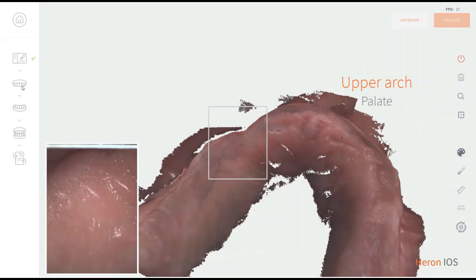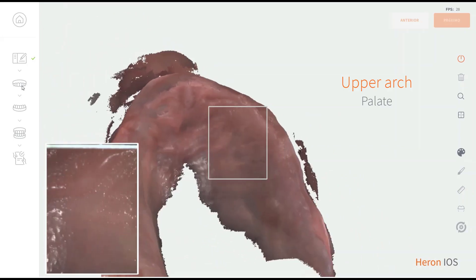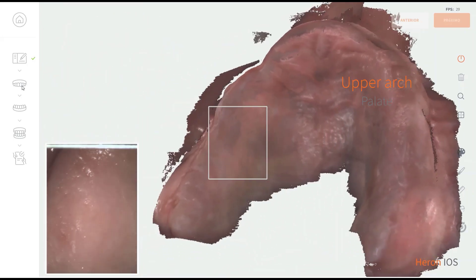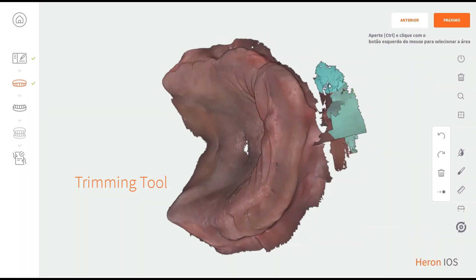If you wish to scan the palate, do it in a zigzag pattern starting from the front. Trimming the excess tissue will help with scanning fluidity and in the bite alignment step.